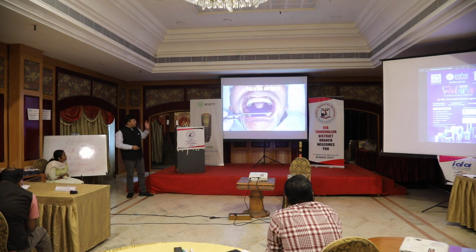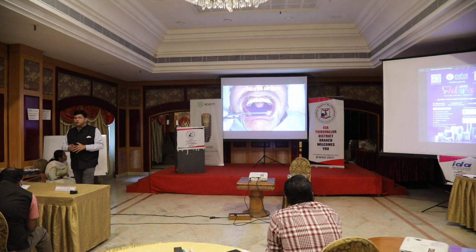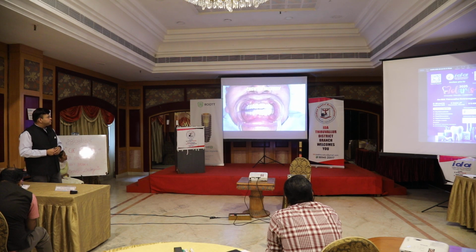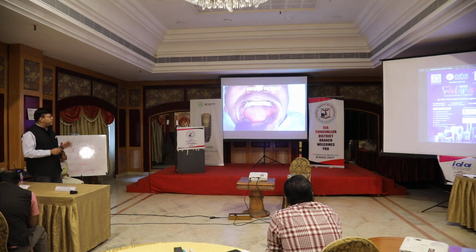Now when I put the paper for a chewing pathway, I put this in the patient's mouth and ask them to give a chewing pathway. One of the final steps to settle occlusion here. When he gives me a chewing pathway, we'll see what kind of markings he has to give us. And whatever markings are present on the non-functional, we are going to remove it.